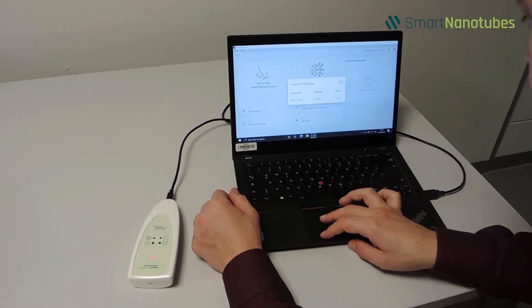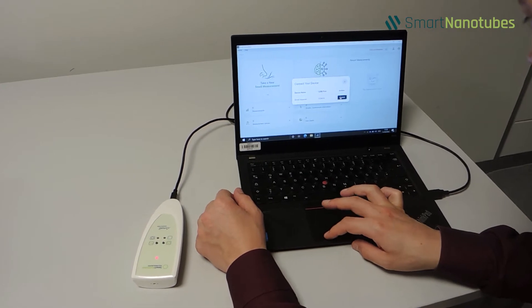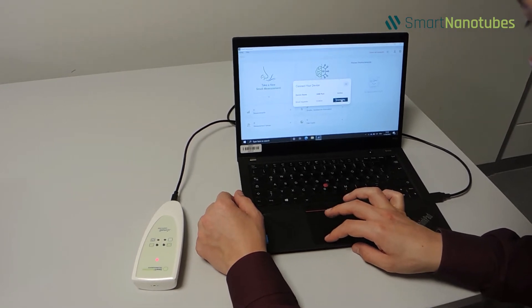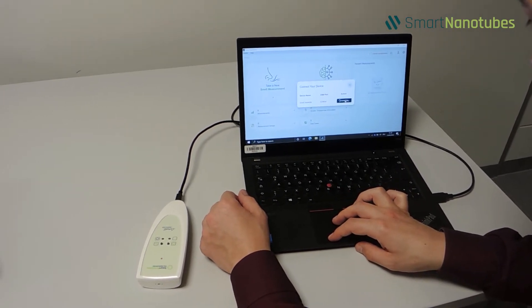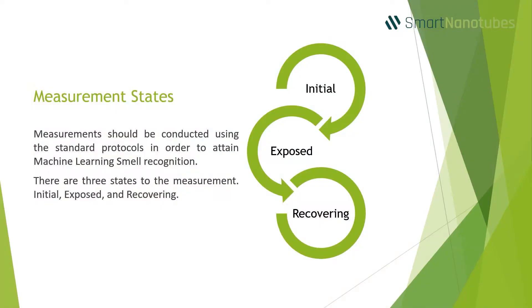To connect to the Smell Inspector device from the app, go to Device Connection and select the available device from the list.